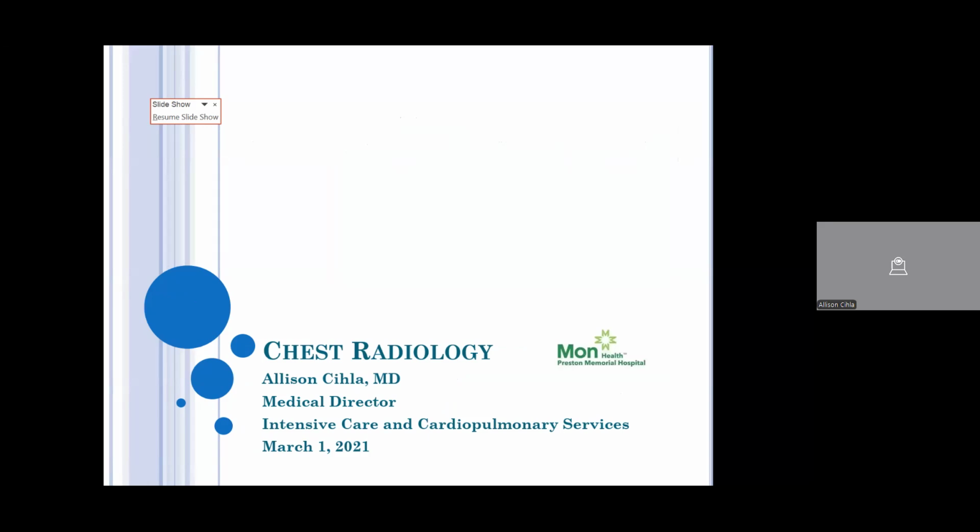So today we're going to talk about chest radiology. There are a lot of slides, and I again apologize for the late start, but I will try to get through as many of these as possible. And if we don't, I can always pick this up on a second lecture if you all desire.